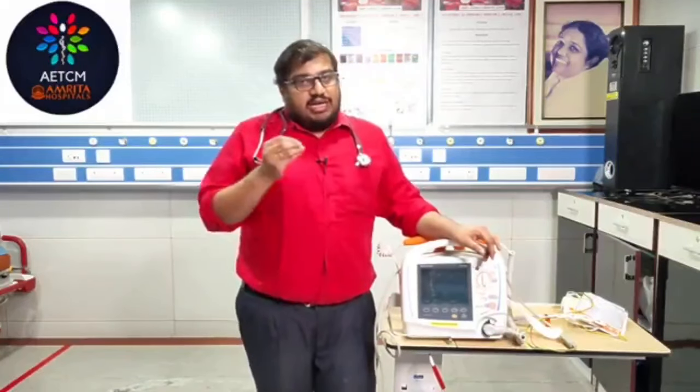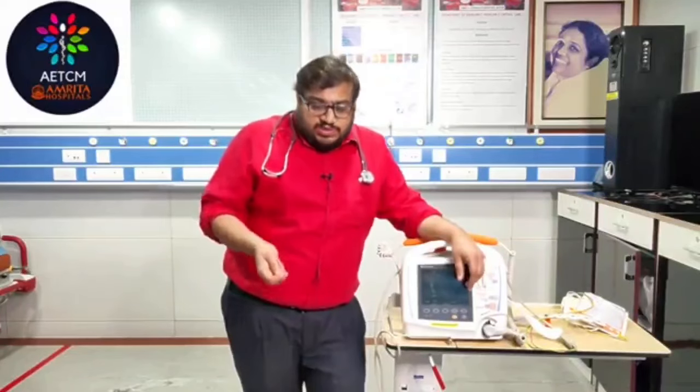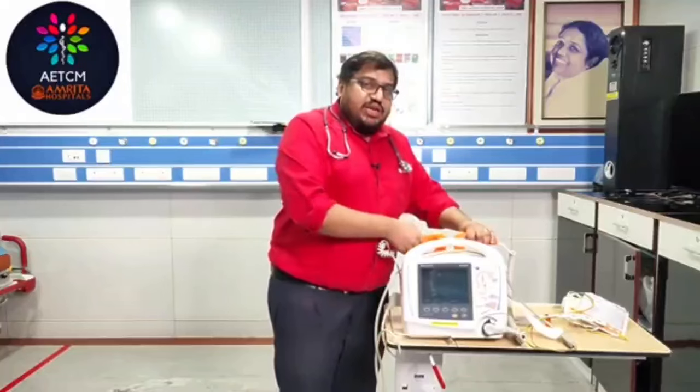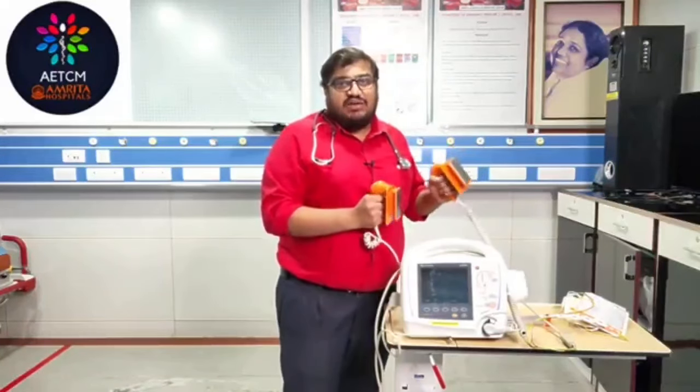So first step, you have switched on the machine. You have selected the energy. The next thing, before touching the patient, you have to make sure that no one else is touching. Before delivering the shock, make sure that no one else is touching the patient. Now we have selected the energy, but this machine is not charged. This paddle doesn't have any energy.